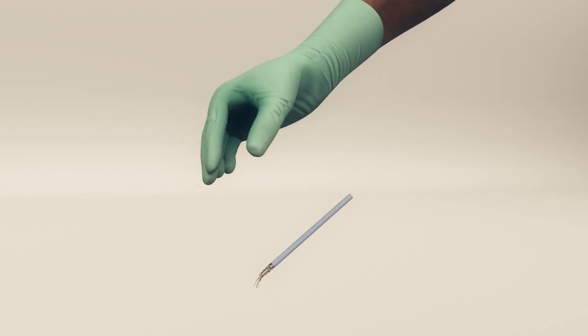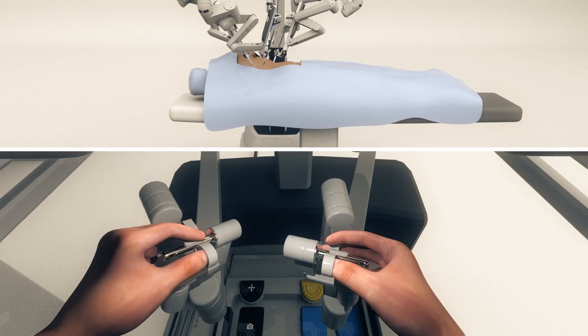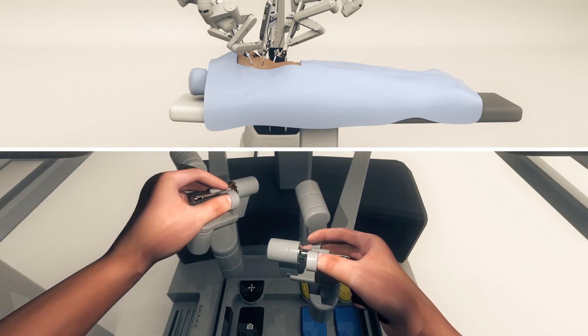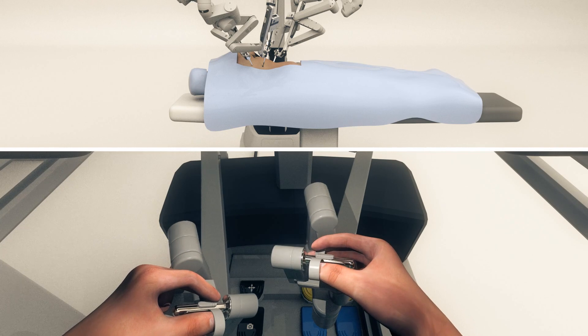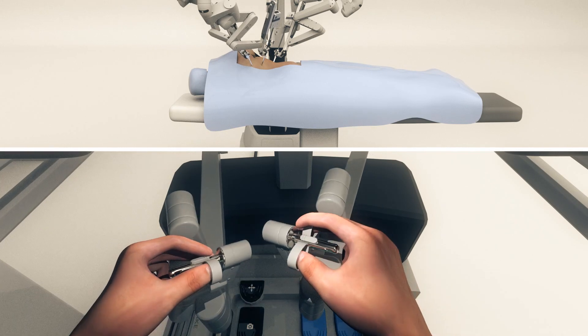In order to control the instruments, the surgeon sits at a console positioned next to the patient in the operating table. The surgeon controls the robot's arms and camera using a combination of hand controls and foot pedals.